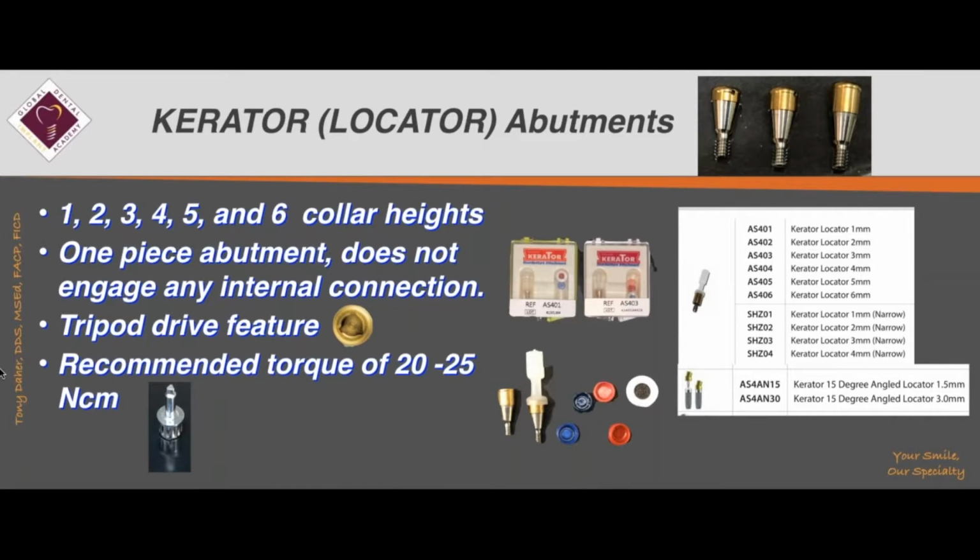Let's talk about the popular attachment for this kind of prosthesis. Locator is a very popular attachment, and if you ask a lot of dentists, this is what they are mostly familiar with. Dentists have different names. It's the same shape, the same size, and the name is Locator.